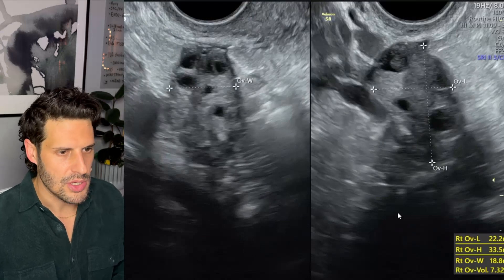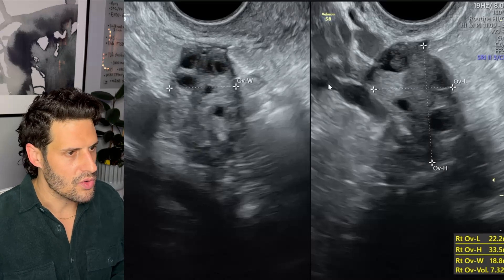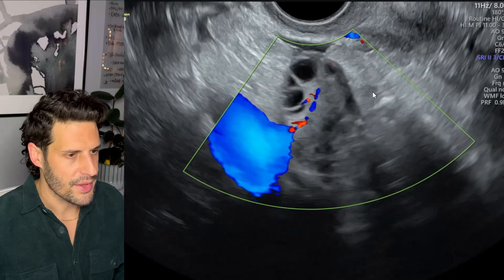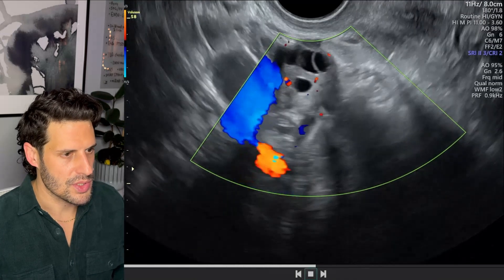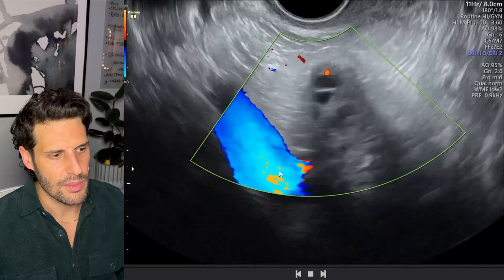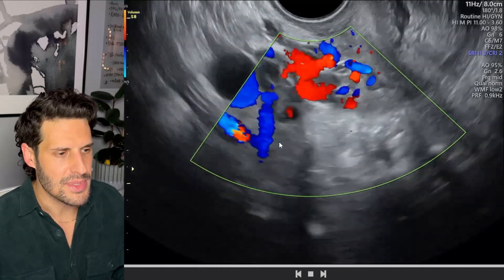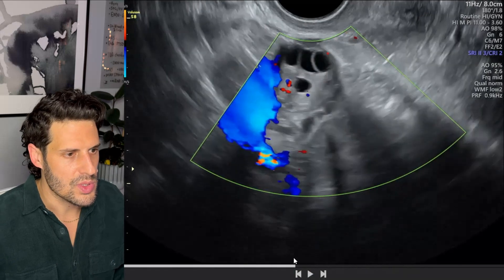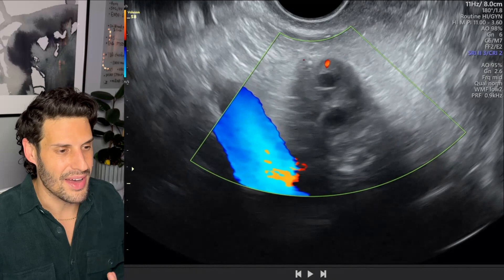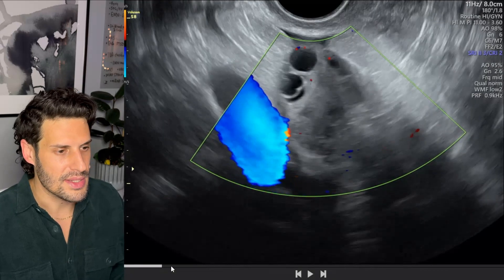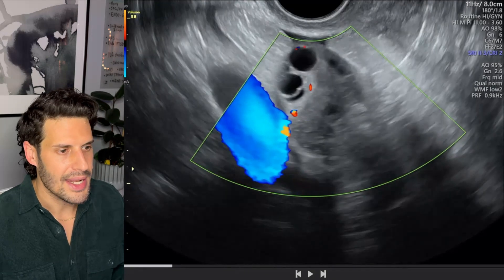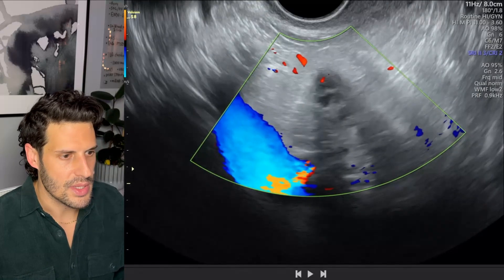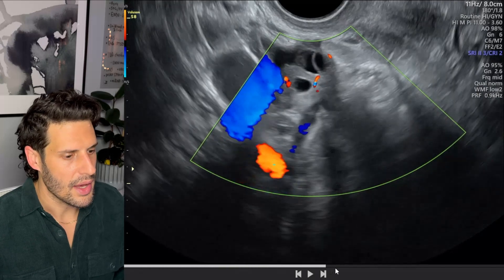Here we have the right ovary measured in three orthogonal planes — it's a normal shape and size. We can see some nice antral follicles. Throwing color Doppler on the ovary shows a normal pattern. A sweep through the ovary is always really important — ideally with color flow and without. One of the things I do almost always is a brief follicle count, particularly if I have a subjective concern for polycystic ovarian morphology at more than 20 follicles. I did a count on this already, and this ovary has about 14 to 15 follicles — less than 20.